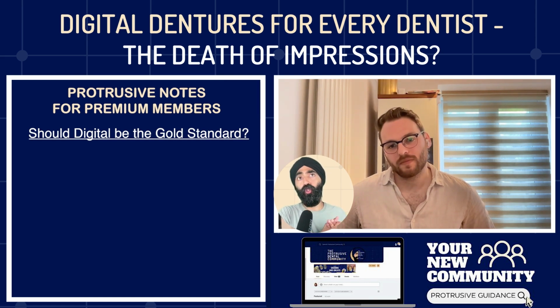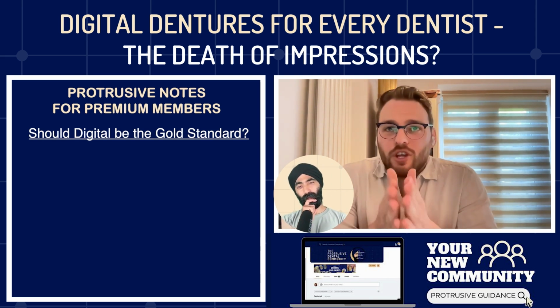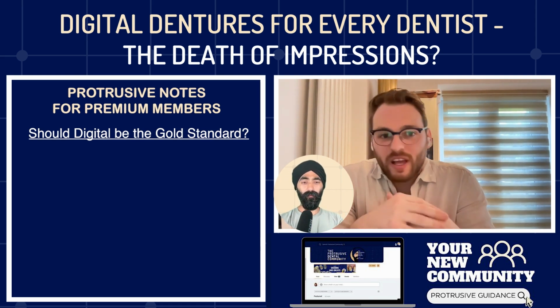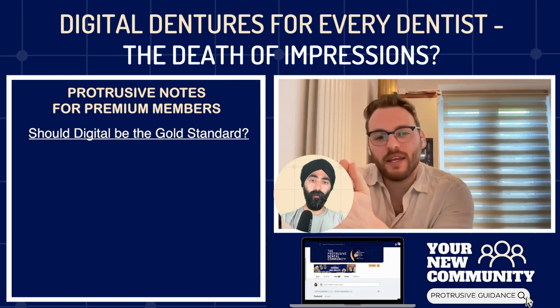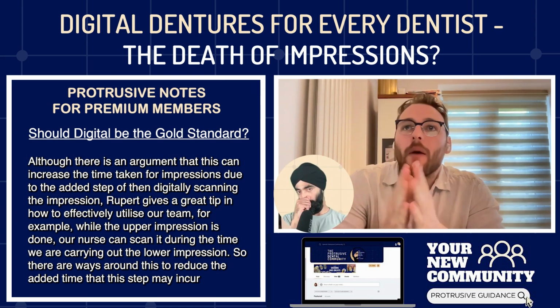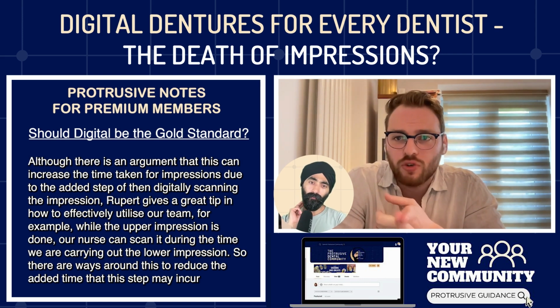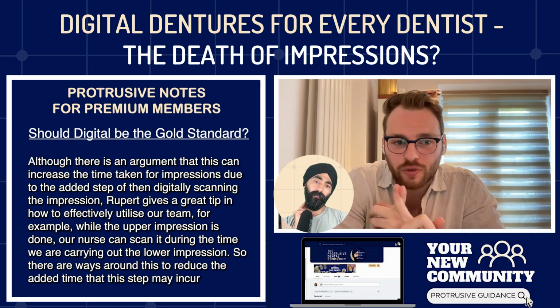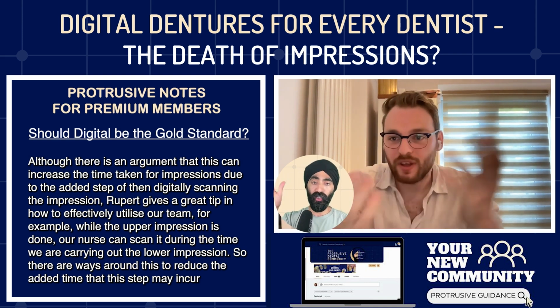And do you think that we should be moving this workflow, this exact workflow you described, whereby you take an impression and scan it, should that become the standard? Yes, I think in terms of the laboratory costs at the moment, it's more or less the same, because it can be a little bit more expensive because there's more time taken in finessing them at the end with the artistry and stuff to make them look good. In terms of your clinical time, yes, the scanning is going to take you a little bit of time, but at the same time, whilst you're taking the opposing alginate, your nurse could be scanning the impression for you. And the whole no postage thing is also a winner.